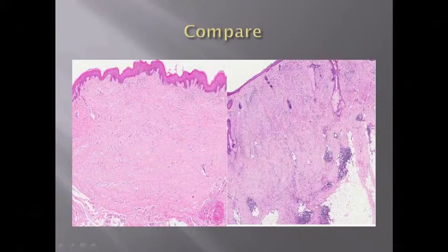But having said that, I have seen scars with lymphoid follicles surrounding them, but that is when you take the patient's details into consideration, such as the age, the site, and of course, then you look into the lesion itself quite carefully.